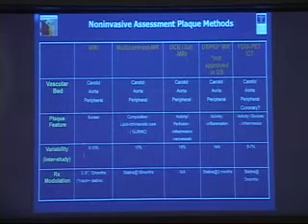Now, specifically for atherosclerosis, the data we have is that it has good variability from an inter-study point of view. So when you're doing power calculations and repeat studies and multi-center trials, this kind of measurement is strong in the carotid, in the aorta, and in the periphery. But it is actually weak or even absent in the coronary artery from that point of view.